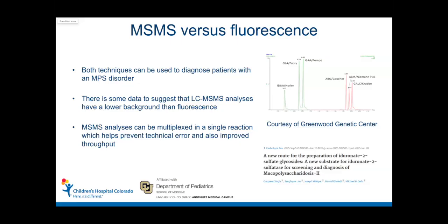It's really powerful, amazing work. But Mike continues to advance and change, and he does have a new paper talking about a new substrate for MPS 2.